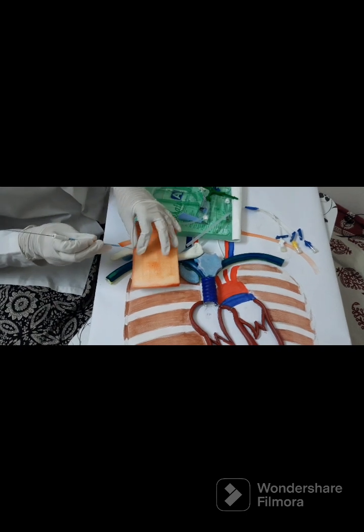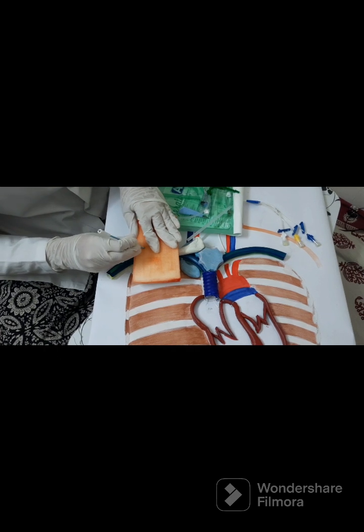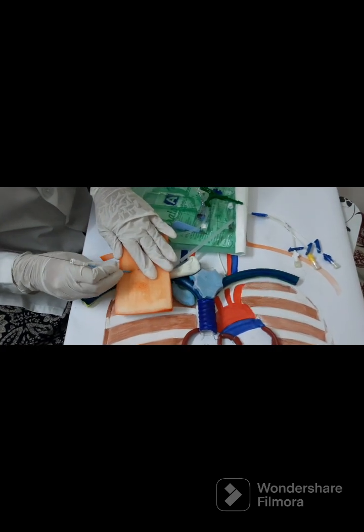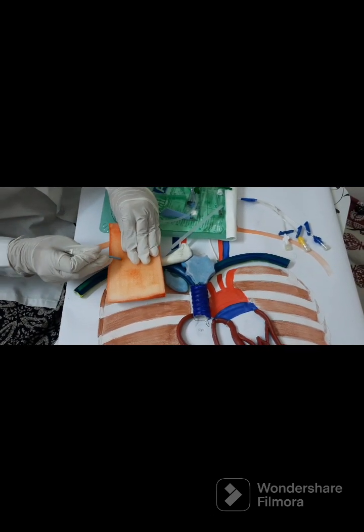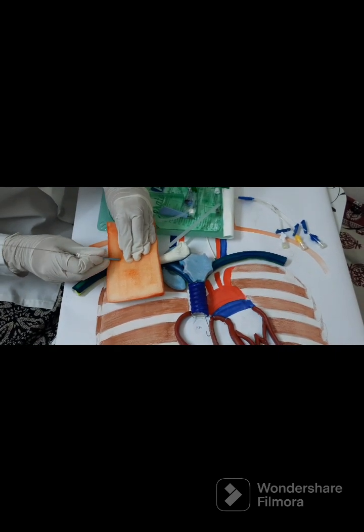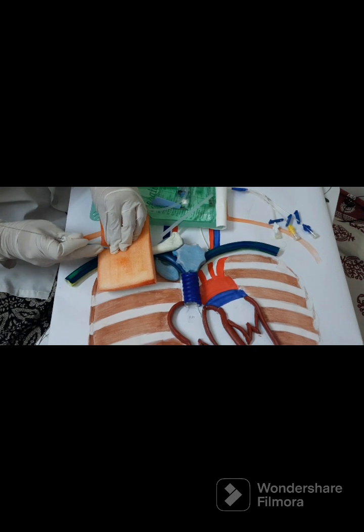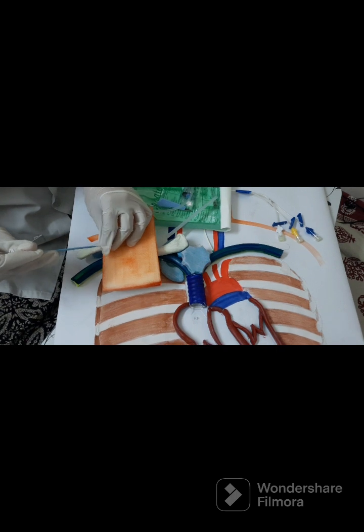As you can see, now I am passing the dilator over the wire gently and firmly over this J-shaped guide wire along the track so that our central line can easily enter the vein. Now we will remove the dilator. We'll keep holding this wire in its place.